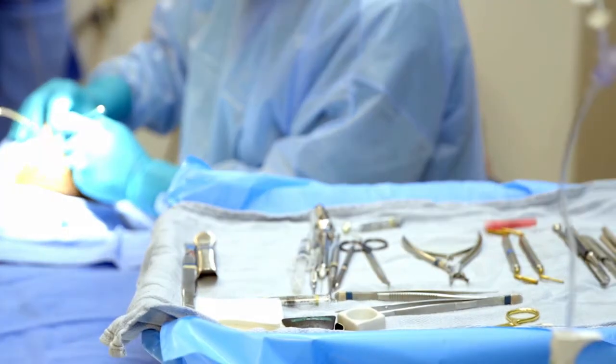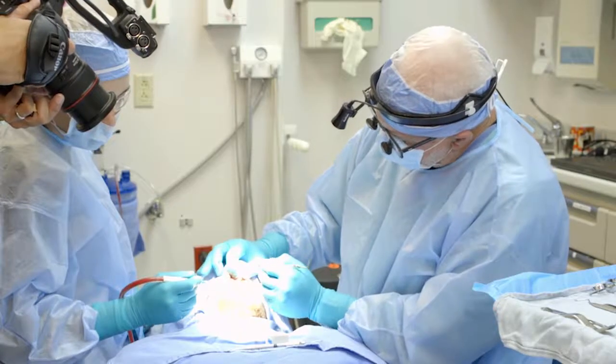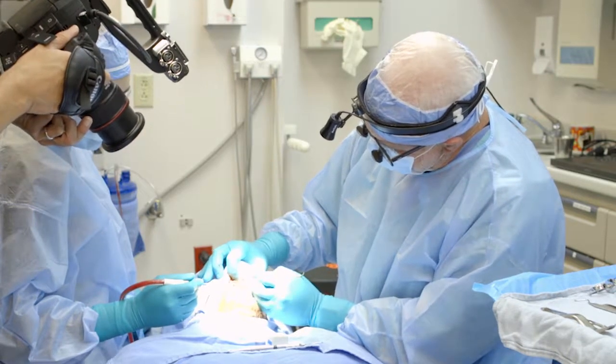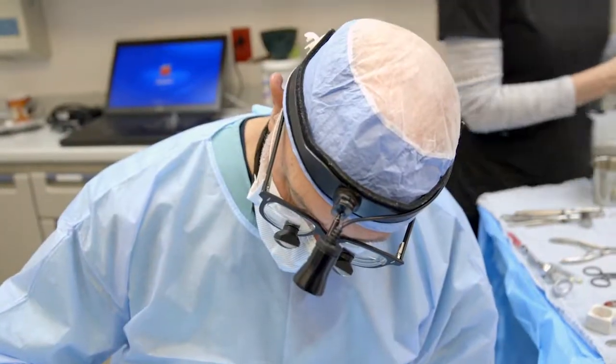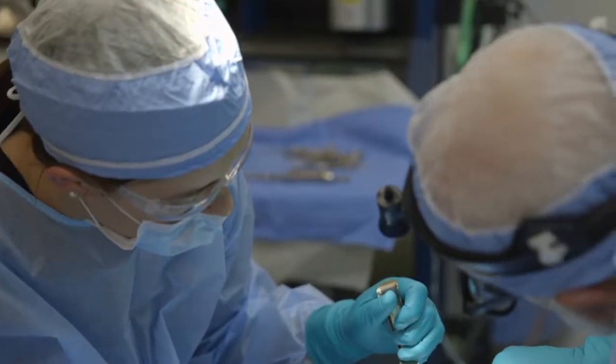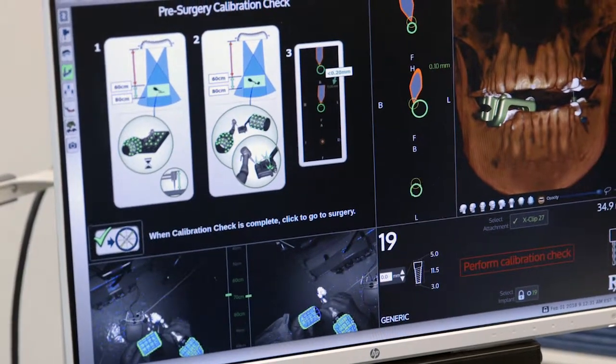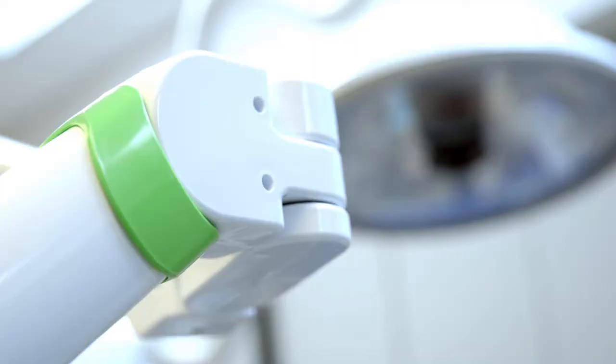The piece of bone that's been pushed forward is still attached to tissue, so it still has blood supply. This will work well. You'll be able to put those implants in at the precise angle that you strive for. The implants will be placed working backwards from where the tooth is — we'll actually be able to place the tooth in the XNAV software and then place the implant so that it's aligned perfectly for the tooth.